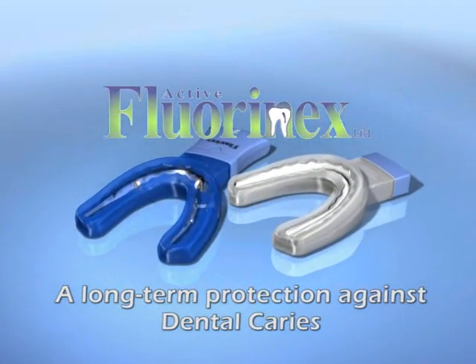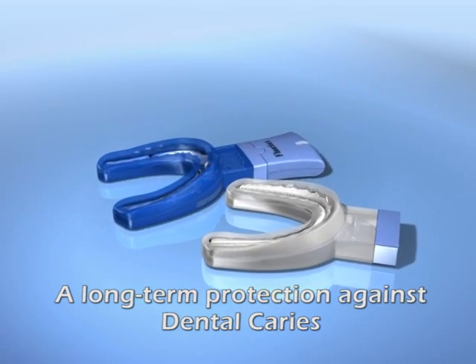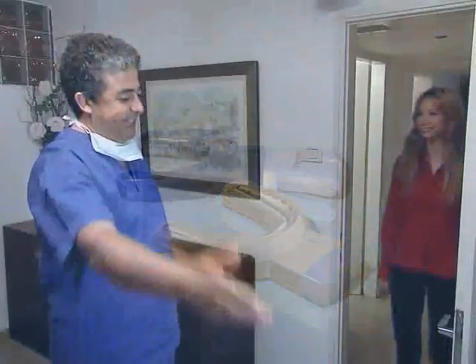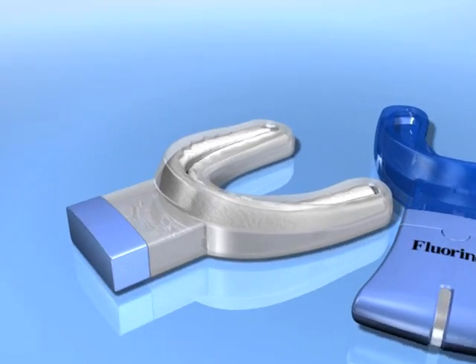Fluorinex presents a revolutionary treatment that provides the maximum fluorine application to the teeth for the longest endurance of time. The Fluorinex procedure is simple and friendly, and it consists of two stages.